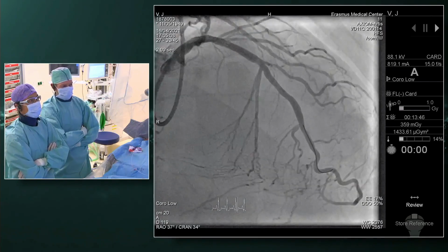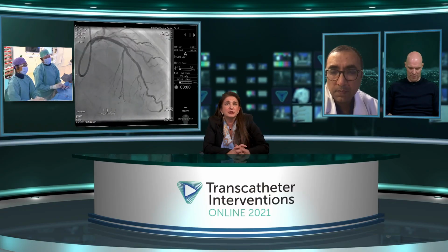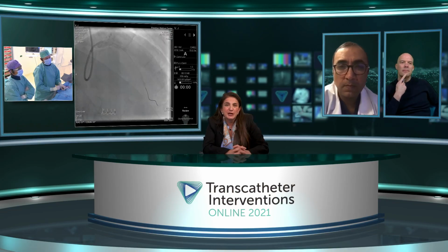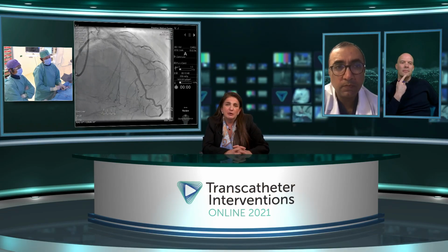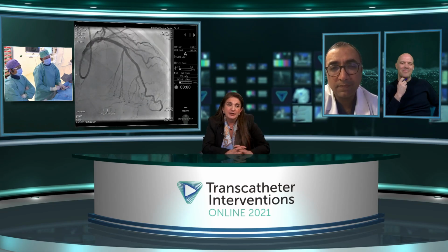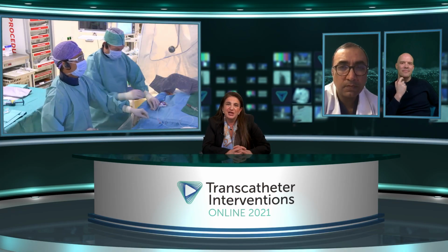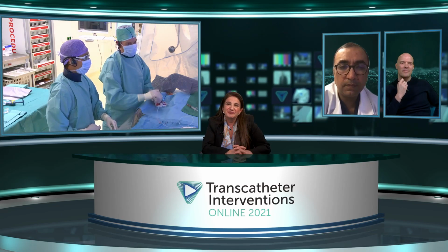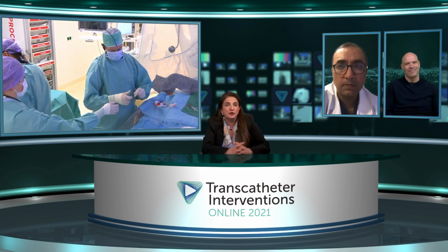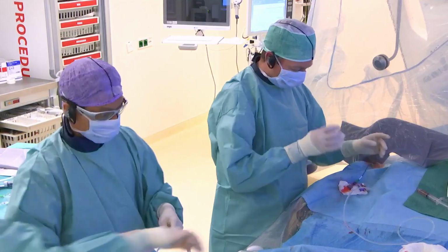This is an incredible, incredible demonstration of orbital atherectomy. Very, very difficult sequential lesions, use of imaging, fantastic work by Erasmus as usual, and a great segue for our breakout session, which is going to be led by Ajay Kirtane on the latest insights on when to use and choose orbital atherectomy. I just can't thank you enough, Nicholas and Azim, for your wonderful comments, Joost for your beautiful team and the work that you guys do and continue to do in Erasmus.